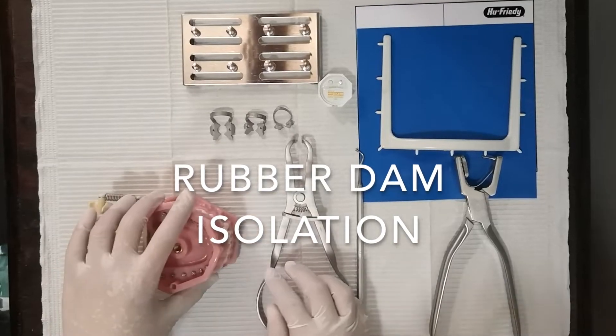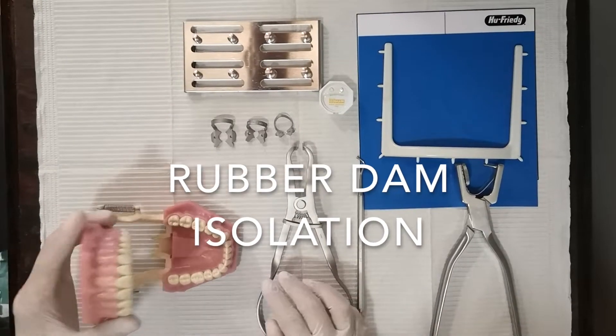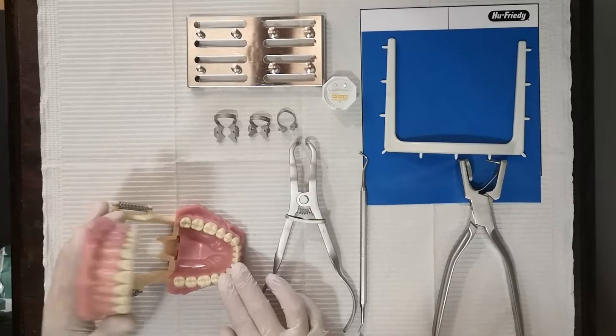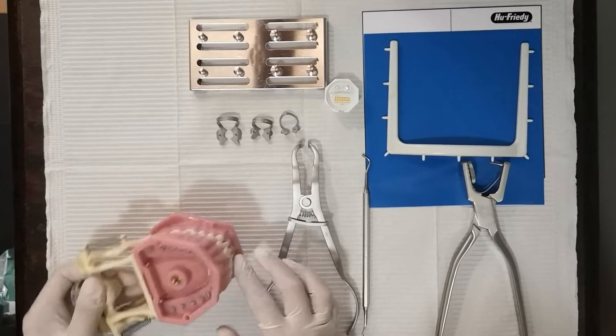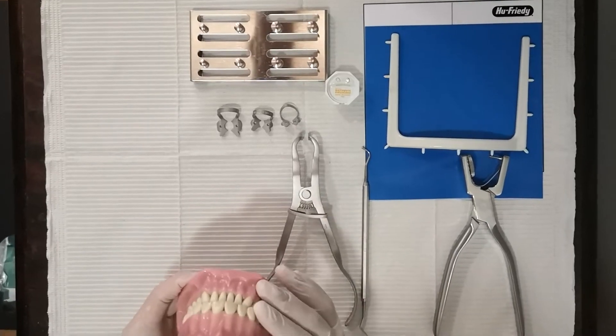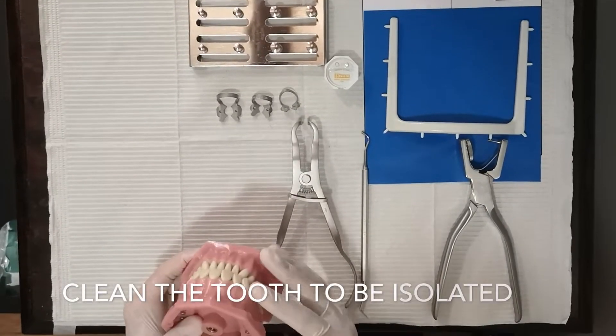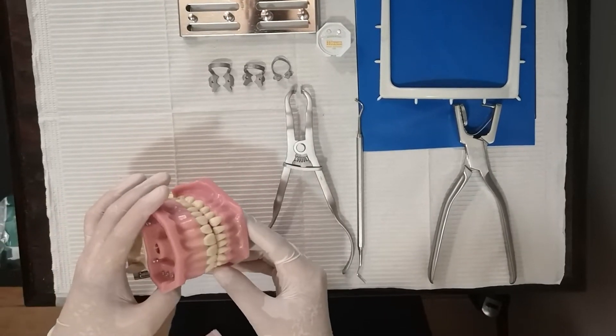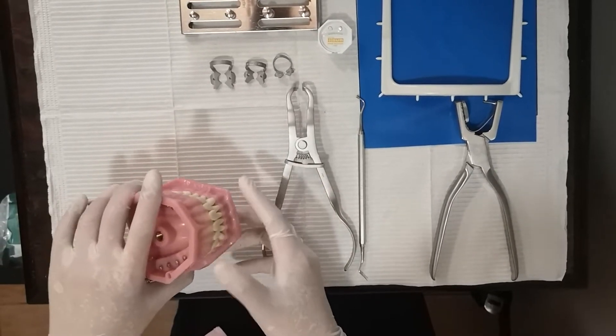Today I'm going to isolate a tooth and demonstrate different techniques in rubber dam isolation. Before you do any isolation, make sure that the tooth is clean. Once you have examined that it is clean, you have to select the clamp.